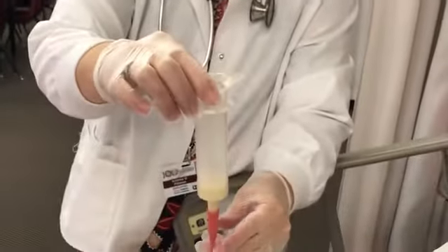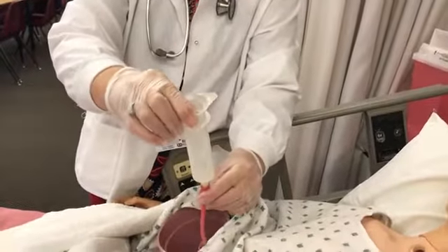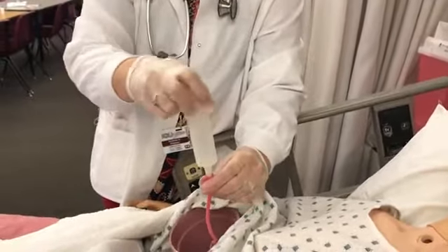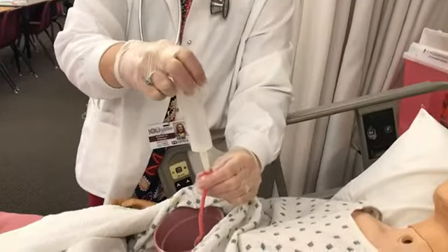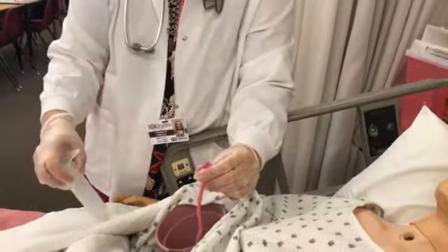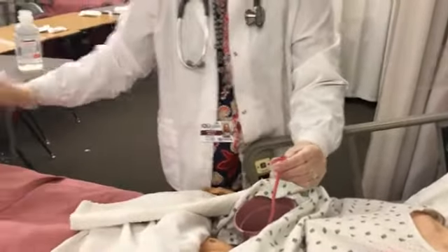So you can kind of see it going to gravity, and you want to make sure you catch it real quick before a lot of air gets in there. Whoop, got it. All right, so we've had 50 cc's of water before, 100 cc's of our feeding, and 50 cc's of our flush. At this point, we can recap our peg.